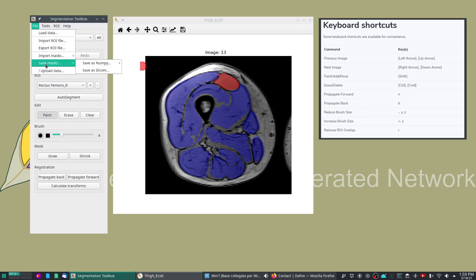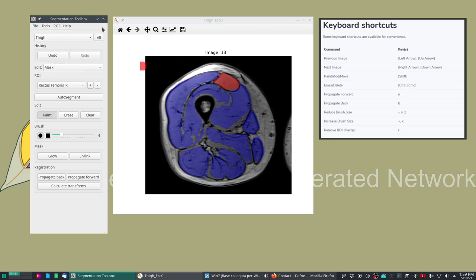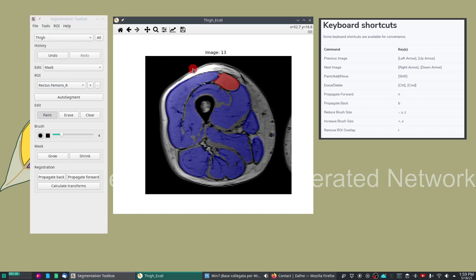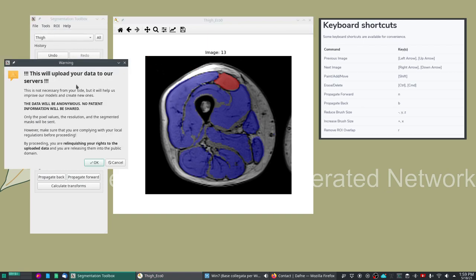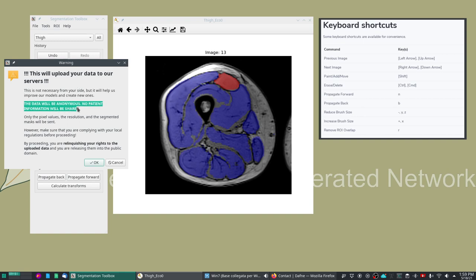Finally the last feature that I wanted to mention is the possibility of uploading the data. This will package your data and your segmentation and upload them to our servers. I mentioned in the beginning that this is absolutely not a necessary step. This is something that you can do for your convenience if you want to show us some usage case and you have the right to do so. The data that is sent will be anonymous but you have to make sure that you have the right of sending the data across the internet.